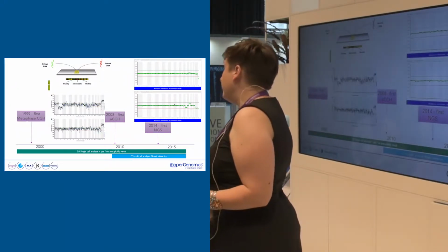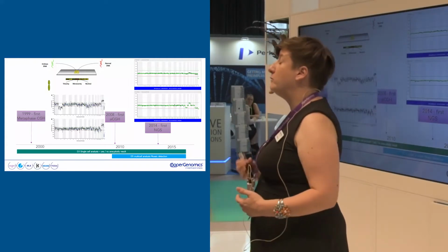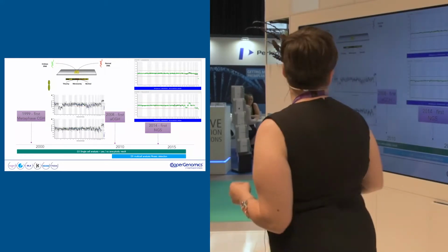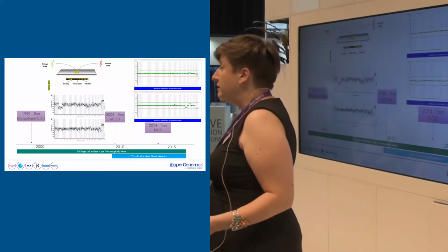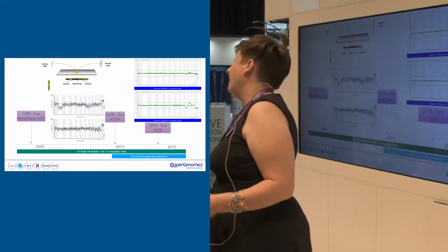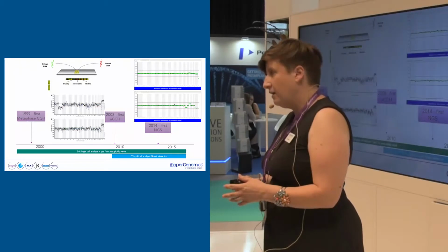They do have a higher rate of miscarriage, but there are healthy babies that are born. And the people who have been in a situation where they've been able to transfer these embryos have now been able to distill that even further to say embryos that have a level of mosaicism of between 20 and 40%, actually their chances of success are pretty much as good as embryos that are euploid, and embryos that have mosaicism at a rate of 40 to 80%, you probably don't want to use.